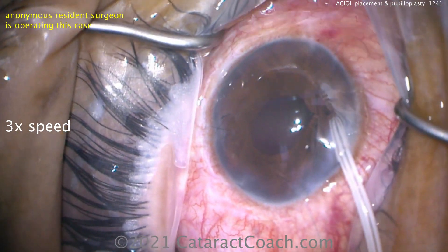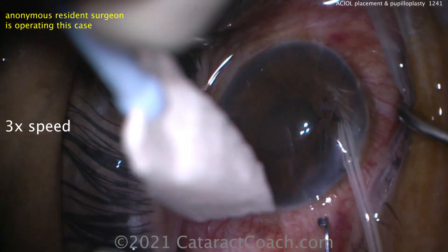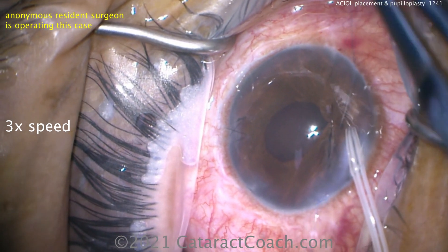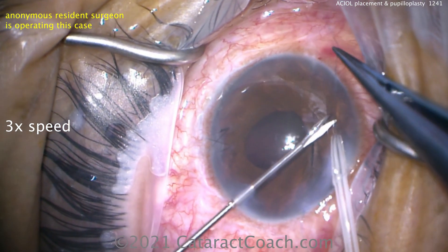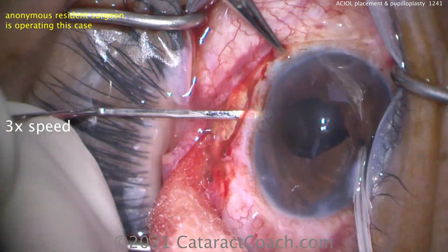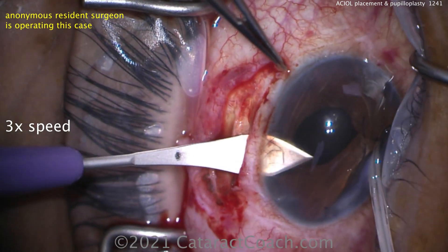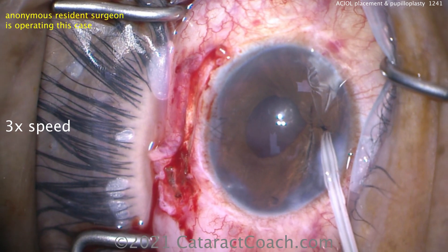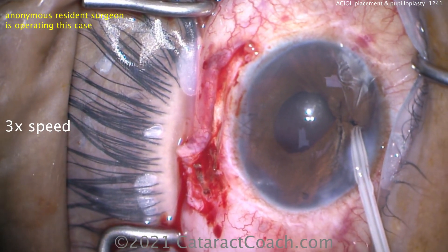We've got that lens being opened up. The pupilloplasty looks pretty darn good. Here's that last suture being pulled through. There's a little cheese wiring of the iris tissue — that's to be expected. Iris tissue is wimpy, especially where it suffered bad trauma — there could be poor blood flow, it may be more friable and delicate than you're expecting. The patient had an original incision to remove the large intraocular foreign body, so we're opening up that original incision and widening it to about 6.5 millimeters. The AC lens has an optic size of 5.5 millimeters and an overall length of 13mm in this case — about a millimeter more than the lens width to account for the thickness of the lens plus the forceps.